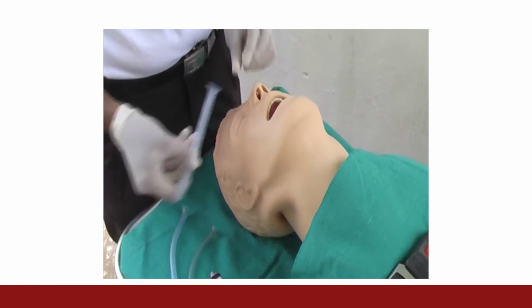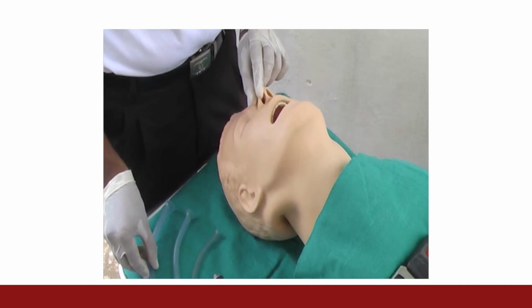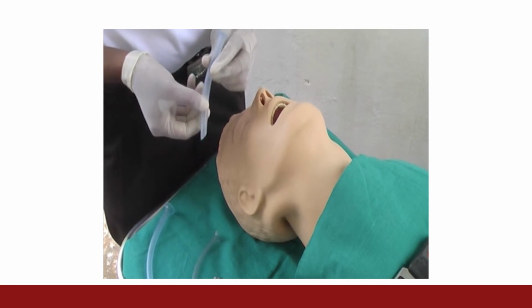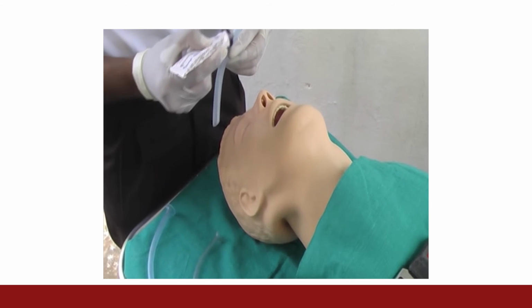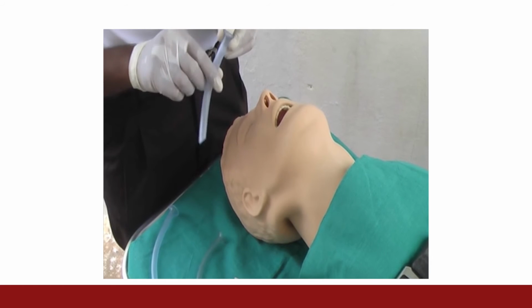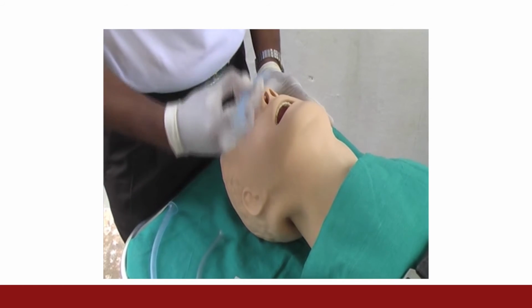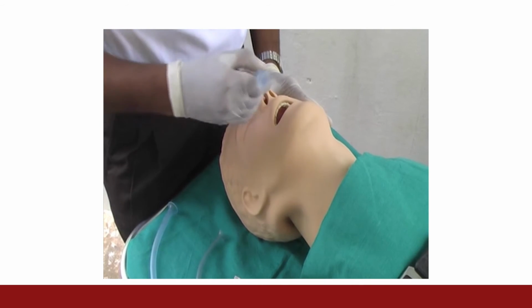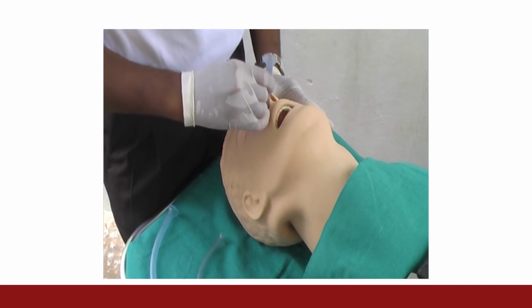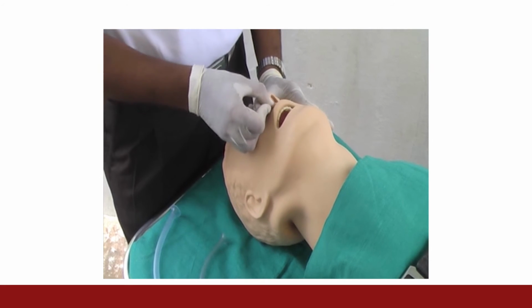Here's a video demonstrating placement of a nasopharyngeal airway into the right nare. The provider first measures the airway, noting it spans past the earlobe and is thus too long. The provider then selects a shorter version, which measures correctly, and lubricates it. As you can see now, when the airway is placed into the right nare, in order to have the bevel facing the septum, it's oriented such that the downward curve of the airway is directed towards the patient's feet. The airway is gently advanced until the flanges are flush with the rim of the nostrils.